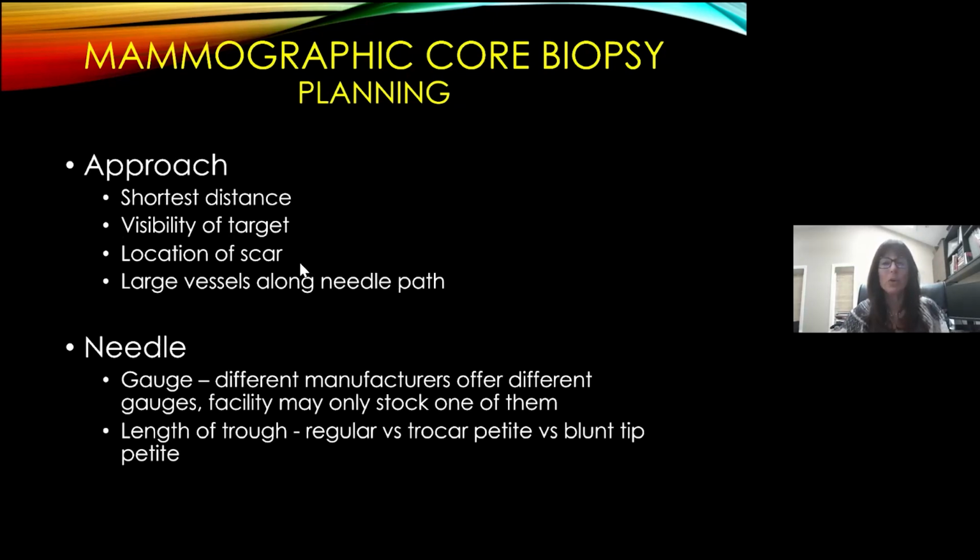Some patients do scar more significantly than others, such as patients who form keloids. So I'd rather bury the skin changes if I can. Another thing to consider for the approach is whether or not you would traverse large vessels going to your target from a particular direction.